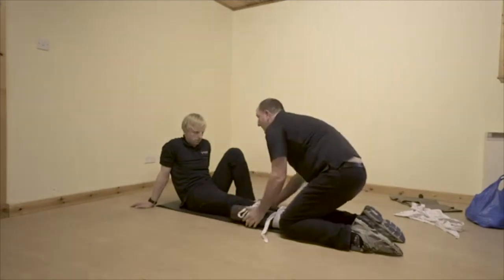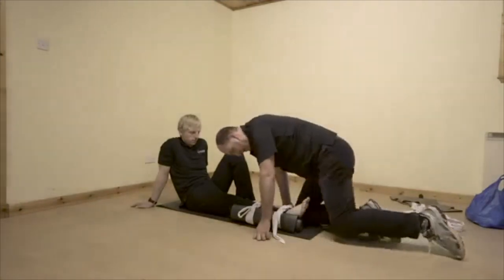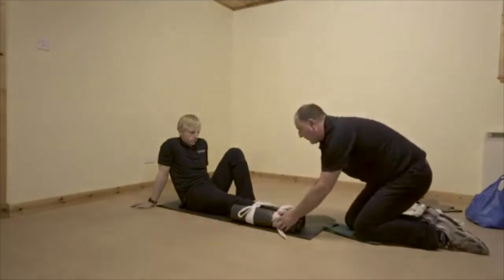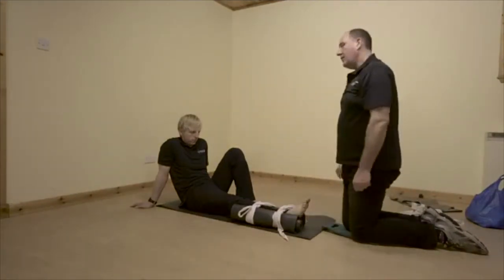How's that feeling, Casualty? A lot better, thank you. Surprisingly comfortable. So now this is here I can slowly move away, and that should be nice and firm and shouldn't move at all - so we've stabilized that lower leg injury.